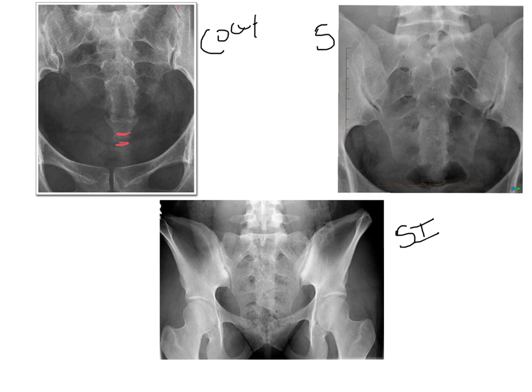So going back to anatomy, we have SI joints here and here. We have sacral foramina. Now, you're not going to see all of the sacral foramina like you do on an AP sacrum. You've got your obturator foramina. This bone right here are your pubis bones. Okay, and below them, right underneath here, are the ischial bones, pubis symphysis, and between the two, this of course is sacrum.